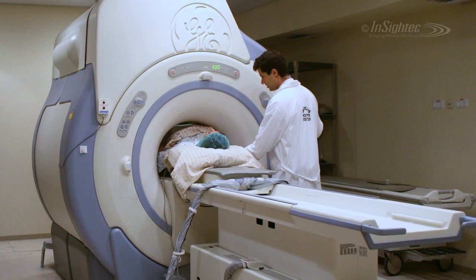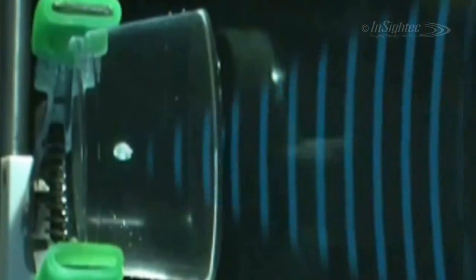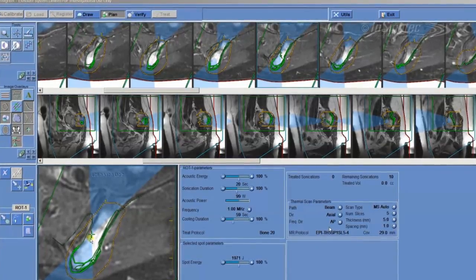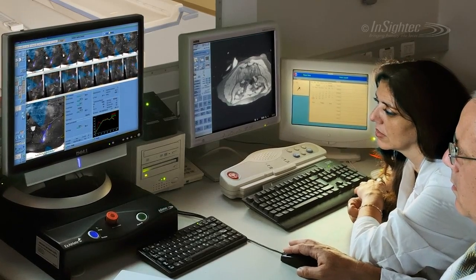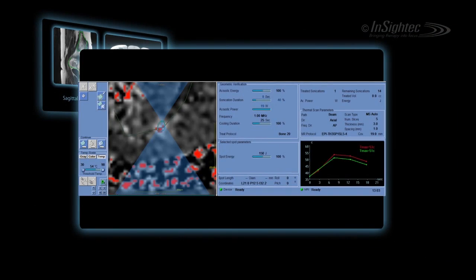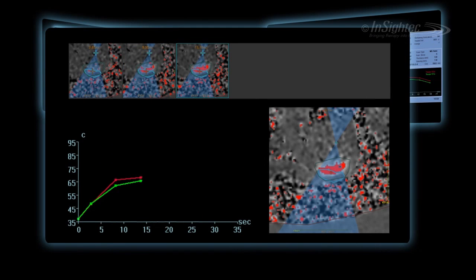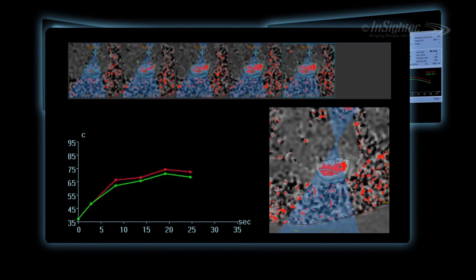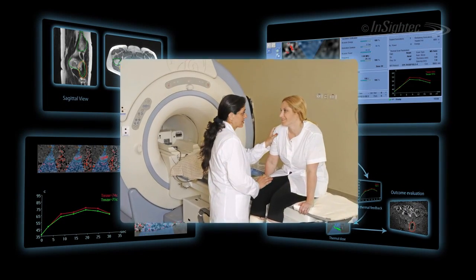Exablate's combination of focused ultrasound and magnetic resonance guidance provides a non-invasive, non-ionizing, personalized treatment, adjusted and optimized to the individual patient's anatomy and response to treatment. It provides MR visualization of anatomy, energy beam path for careful targeting, real-time MR thermometry for monitoring and control, and closed-loop feedback. All these help ensure safety and efficacy of the treatment.